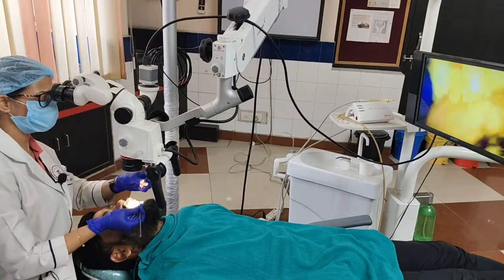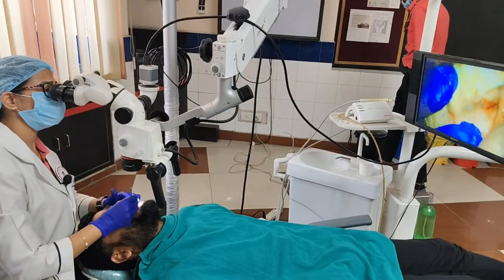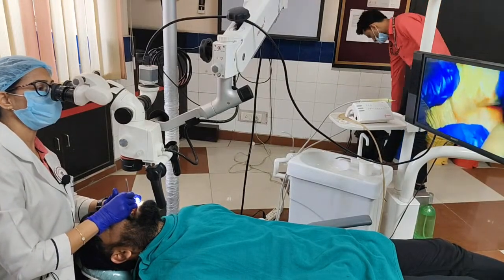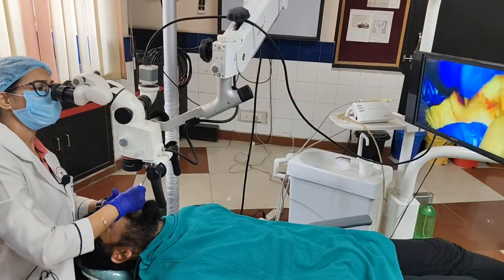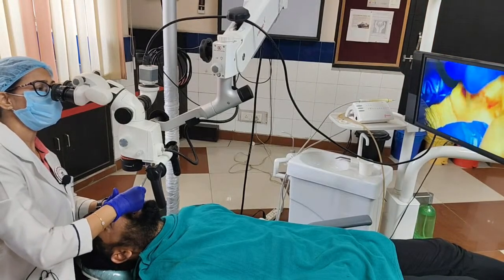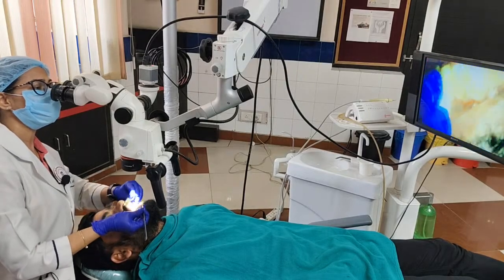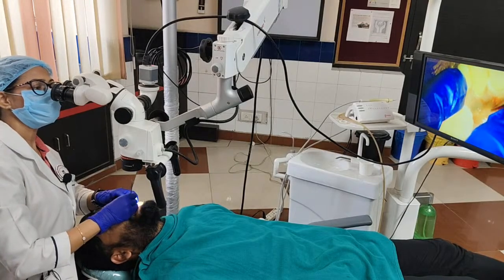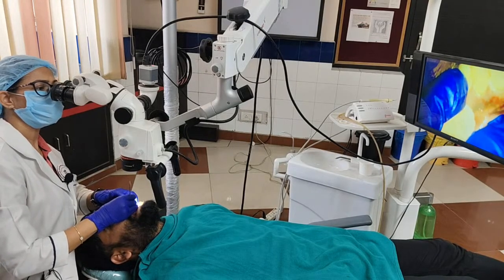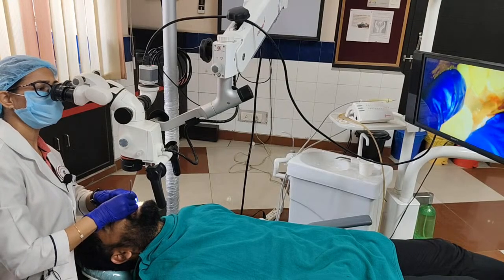And always remember, whenever you do any of the periodontal plastic surgeries, you're always going to keep changing your blades because they tend to lose their efficacy after some amount of time. So you are unnecessarily just scraping away with a blunt instrument. So better is to keep changing the blades and keep repeating it. So he had very mild pigmentation to start with.